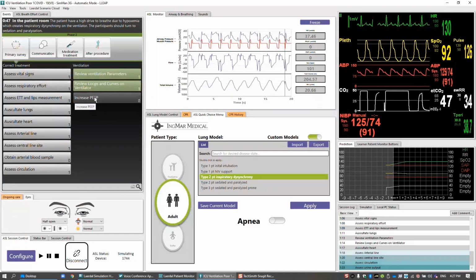It gives us a static pressure inside of the lung, and we never want to go over 30. And increasing the PEEP above what it's set at could violate those plateau pressures and just cause more damage to the patient's lungs. Thanks, Jess.